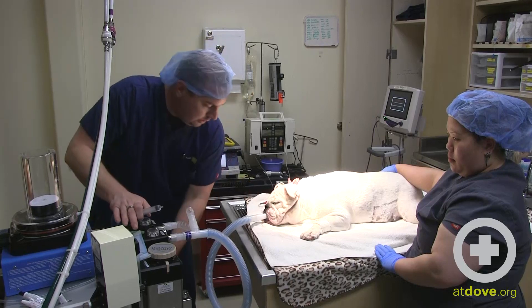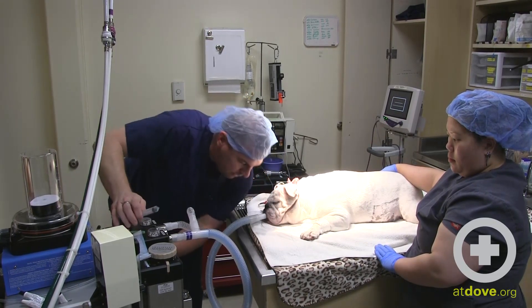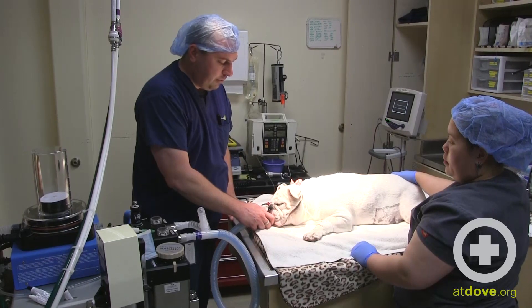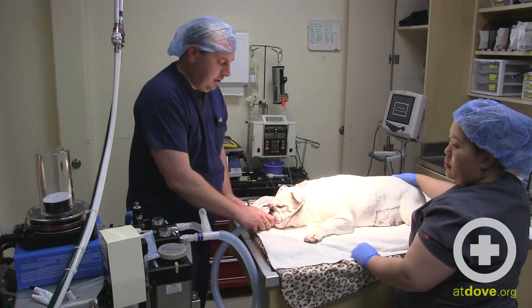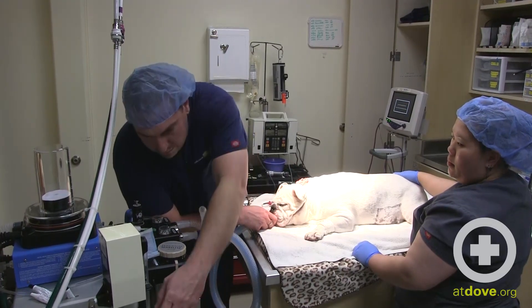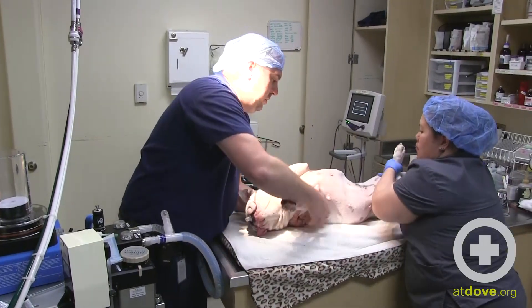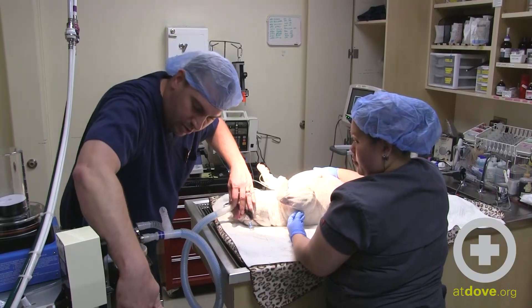Our breath is holding. Before we move this dog onto his back for prep, always disconnect — just to make sure you're not causing any trauma, tracheal tears, or anything like that. I'll turn oxygen off and disconnect, then we'll flip. Now we will reconnect, turn our oxygen on along with some gas, and we're ready to start prepping.